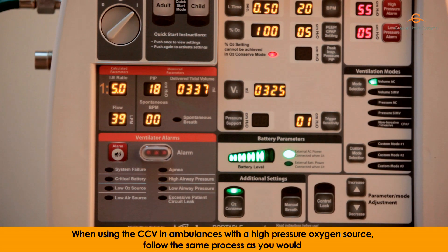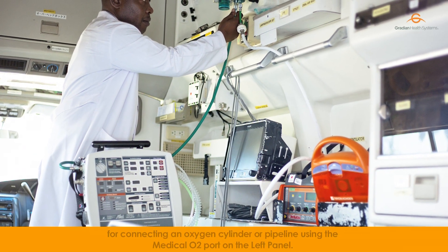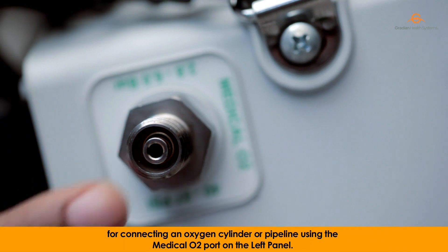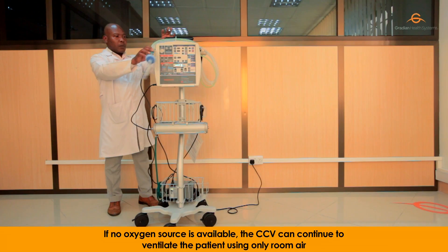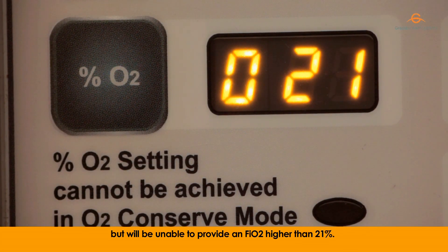When using the CCV in ambulances with a high-pressure oxygen source, follow the same process as you would for connecting an oxygen cylinder or pipeline using the medical O2 port on the left panel. If no oxygen source is available, the CCV can continue to ventilate the patient using only room air, but will be unable to provide an FiO2 higher than 21%.